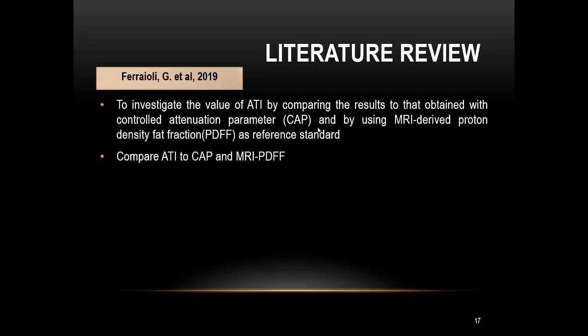The other one is MRI-based proton density fat fraction, which uses the MRI Dixon technique to quantify in-phase and out-of-phase signal and calculate the percent fat inside the liver. MR-PDFF is considered the non-invasive reference standard in clinical practice.